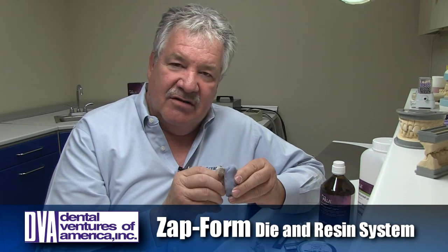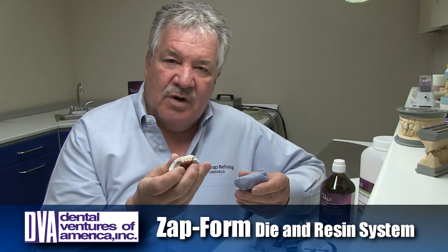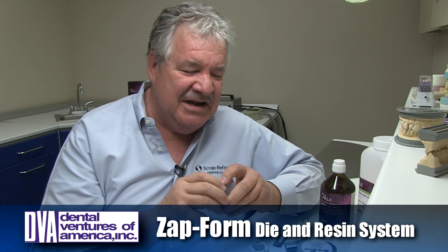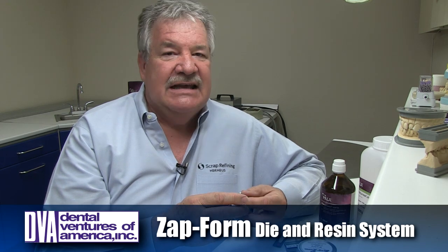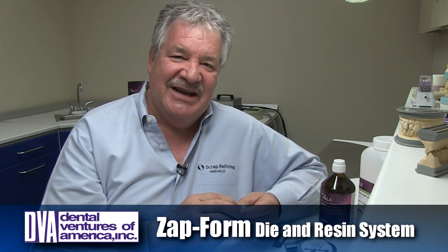Some of you may have seen my article about how to do a partial in less than an hour, where we use silicone putty. Silicone putty is expensive and it's not super accurate. I've come across something — I know there are quite a few of you that I've done the demonstration with — using a hot melt compound.